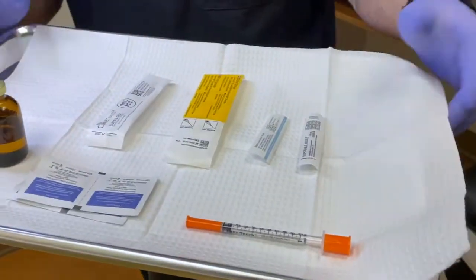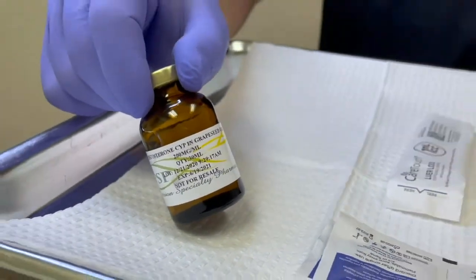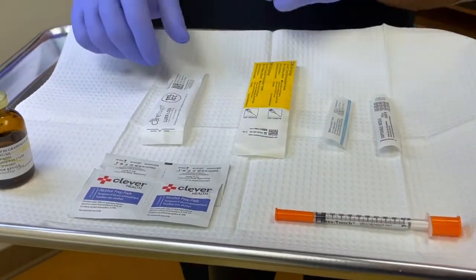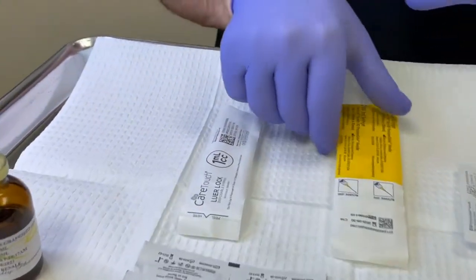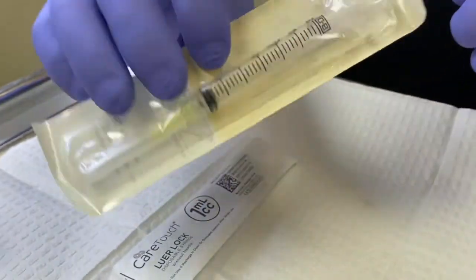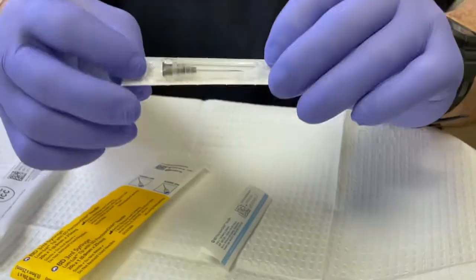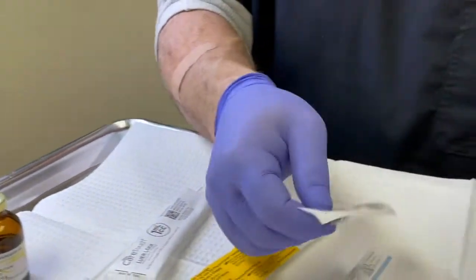I have a few things on the tray here to show you. Obviously you'll have your testosterone — we use Precision Specialty Pharmacy as our source. I also have alcohol wipes, and three different syringes: a 1ml luer lock, a 3ml luer lock with a 20-gauge one-inch needle, a 25-gauge one-inch needle for injection, and a 22-gauge one-inch draw needle for loading from the vial.